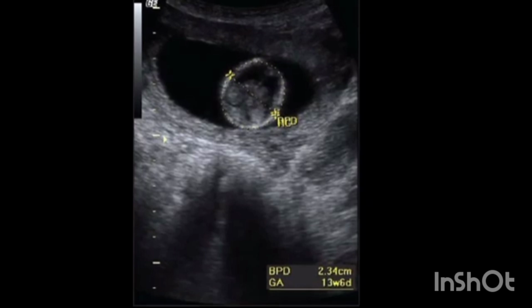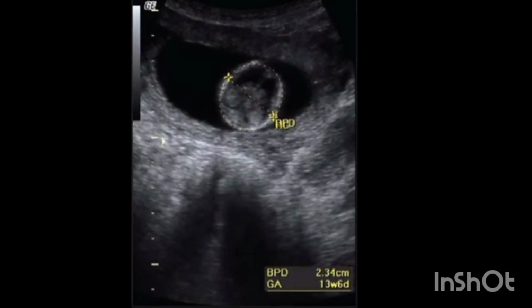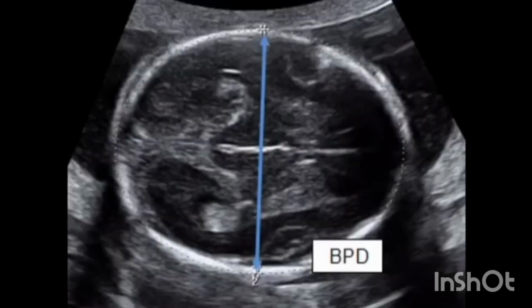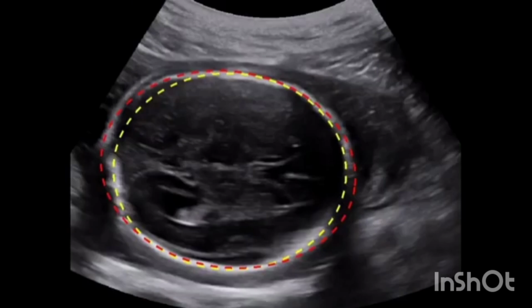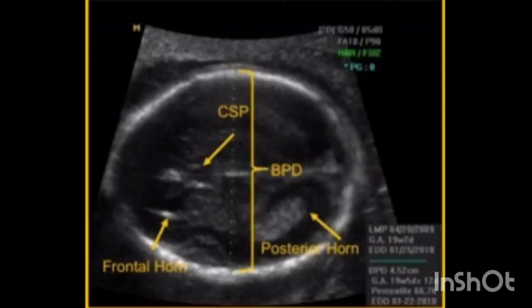The biparietal diameter is useful for dating a pregnancy and in estimating intrauterine fetal weight in weight equations. The latter has the advantage that all three measurements, biparietal diameter, head circumference and ventricular atrium, can be taken in the same section. The calipers should be placed at the widest part of the skull, perpendicular to the midline echo. Other than that, its value is limited and can sometimes be misleading in the assessment of growth of the fetus if it is the sole measurement taken for interpretation.